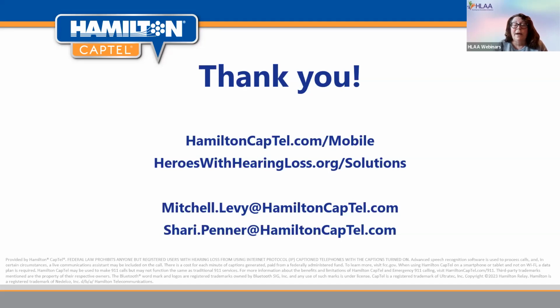Another question: do you have to have CapTel on your home landline to use the CapTel app? You can use that. It's not related. So if you have a CapTel phone at home, you can use the Hamilton CapTel app as well. Both of them are not related. As far as providing service, it's just another solution or product that you can use.